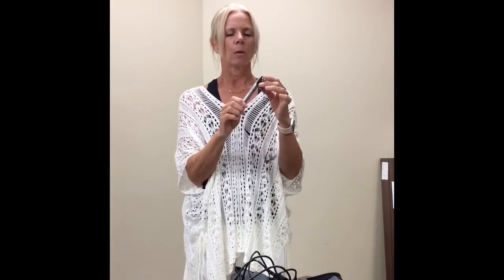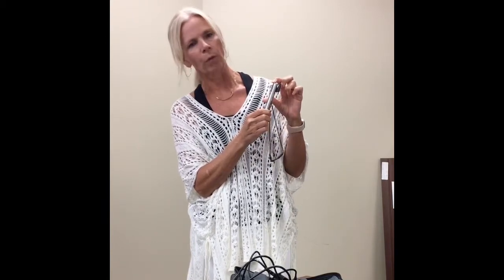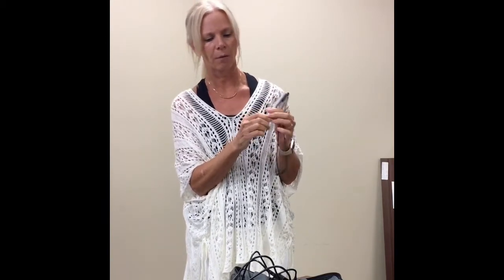You need to keep up with the case, have it kept in a location. In our middle schools or high schools, it can be kept in a classroom, or it can be kept in the nurse's station. Oftentimes we'll keep them in the nurse's station because it's just a centralized location. You want to make sure the microphone is turned off. So I'm going to press and hold, and it will flash red indicating it's turned off.